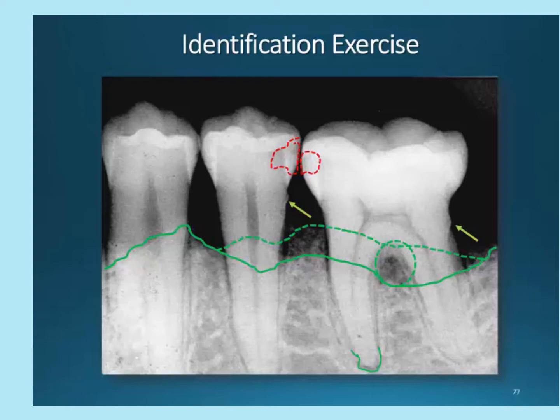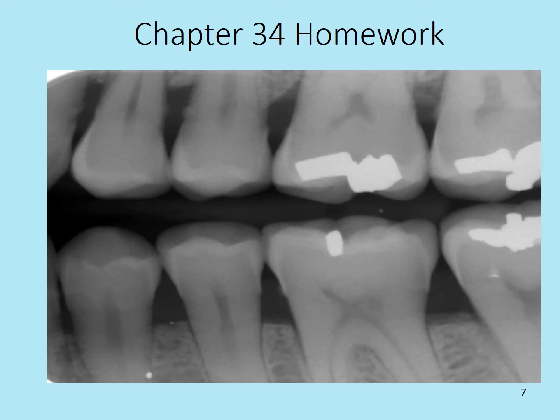So if this was an isolated area in the mouth, it would be a 3, possibly a 4. We would need probing tests to confirm. The rest of the mouth may be 3 to 4 millimeter readings throughout in a generalized class 2. This is a bit confusing at first, but again, we will learn this later on in your education. As you can see, there are a few areas of calculus on the distal of 19 and 20. Follow the homework assignment instructions for illustrating the conditions found in this radiograph.